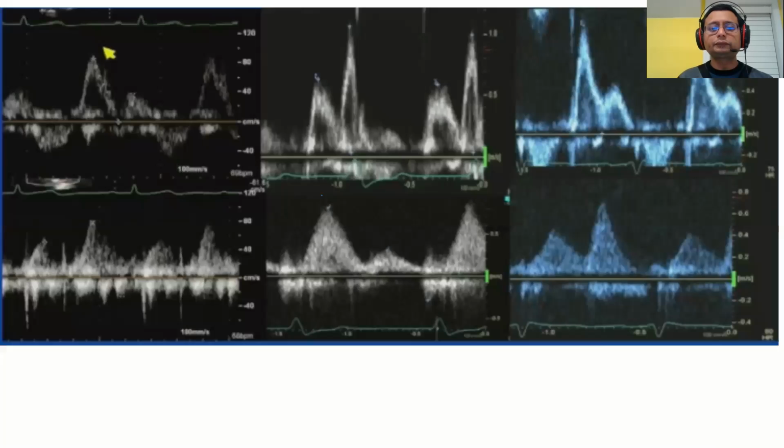This is again showing you the difference in terms of the pulse Doppler and the pulmonary vein Doppler. Okay, this is someone with normal filling. This someone is young and healthy. You can see the E is very high, the A is very low. The left ventricle is actually sucking blood in, and correspondingly, the systolic component of the pulmonary vein is shorter than the diastolic component, and the pulmonary vein reversal is very short.